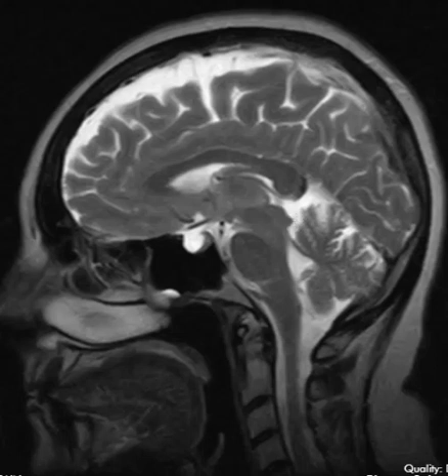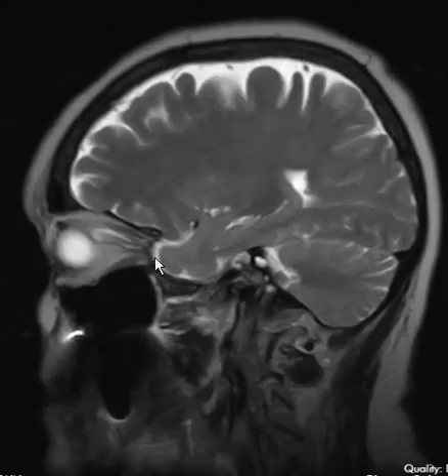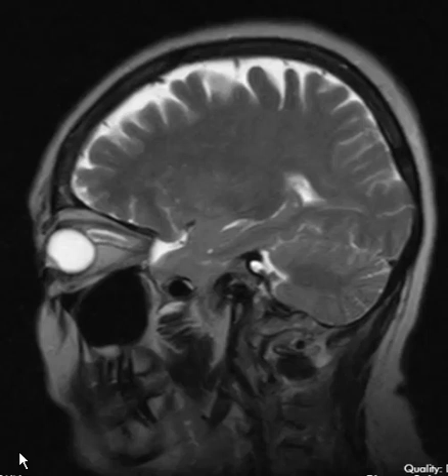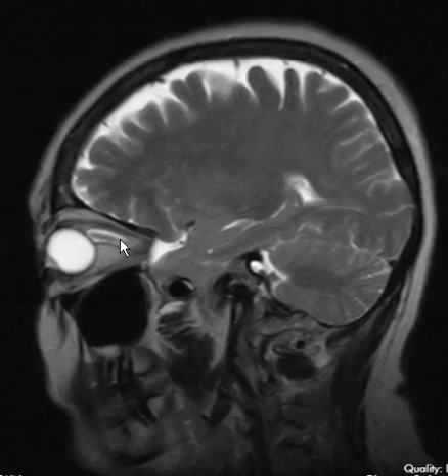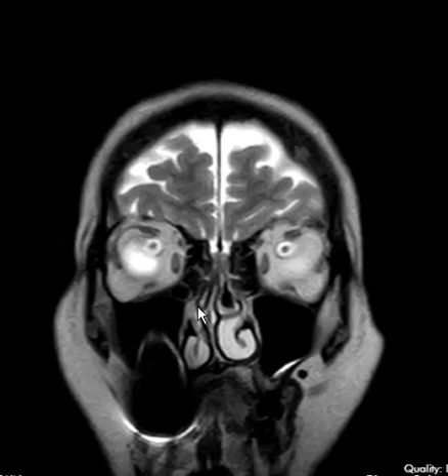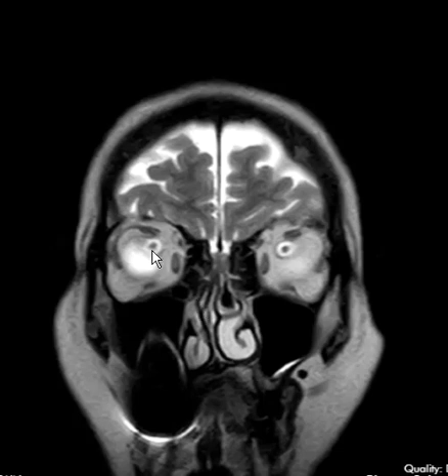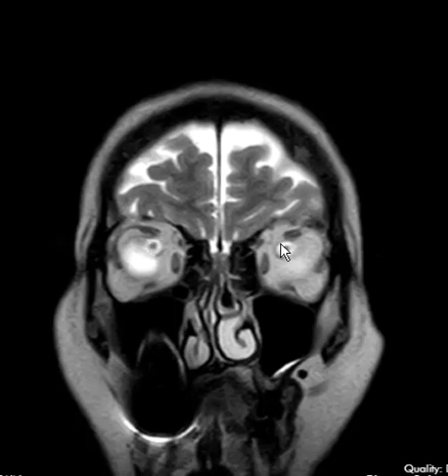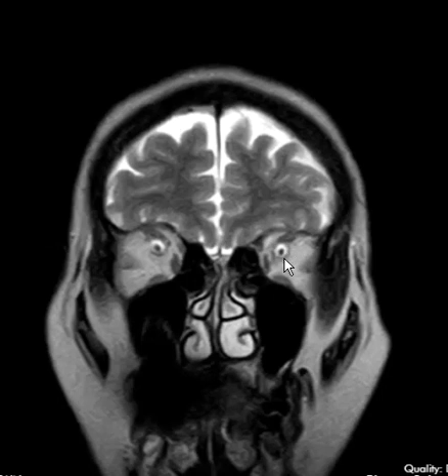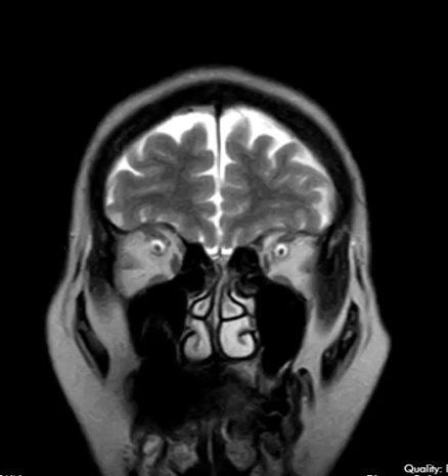But in this patient, she also had some prominence of the optic nerve sheath complexes — it's not really that well seen there, but you can see it a little bit better here. With age this can also be a normal finding, and this is more borderline. But this is something to look for when you see the deficiency of the diaphragma sellae. You can see here the optic nerve sheaths — there's some white fluid surrounding the optic nerve. These are a little bit prominent, a little bit distended, but the patient's 60, so this is a borderline finding.